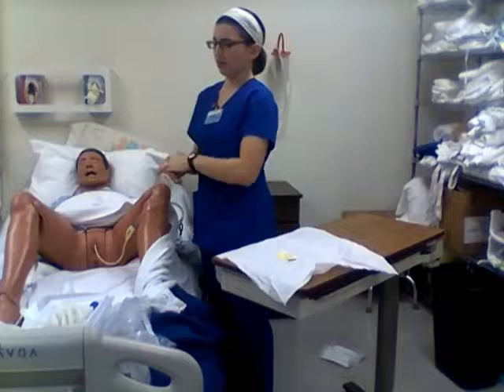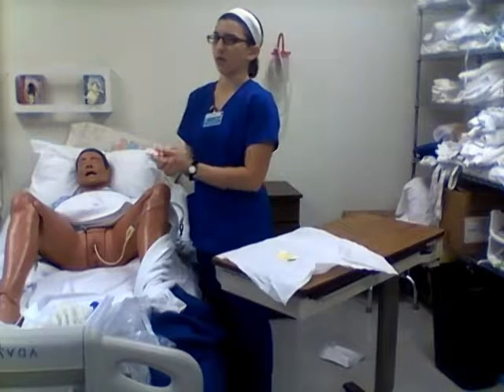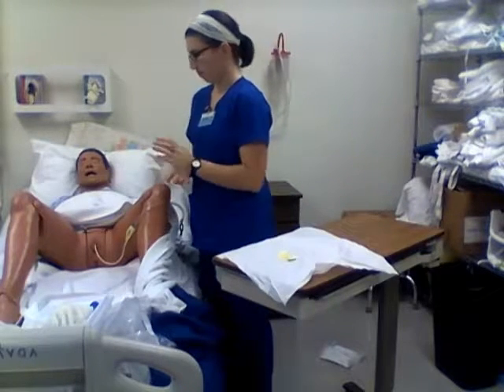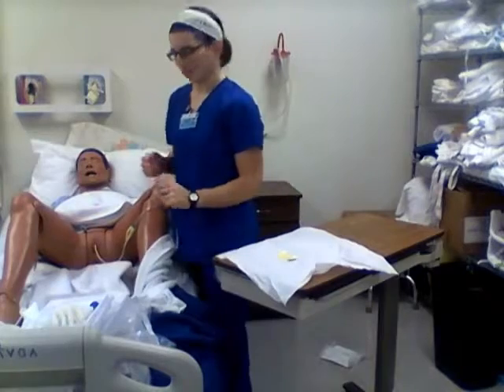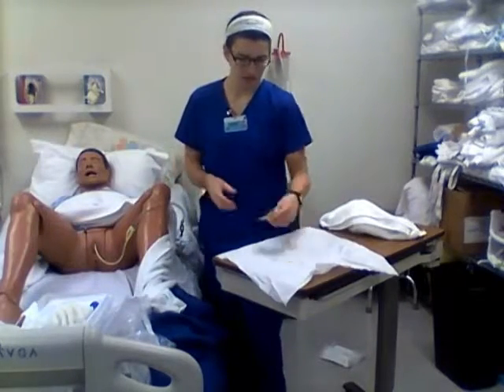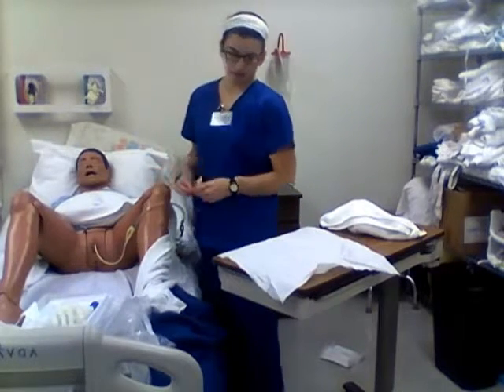And if she was feeling any discomfort, if she was feeling any pain, she could report that to me, and I could possibly help remedy that, or I'd have to document it, obviously, and anything else that could possibly go along with it, I could do that. So now I can go ahead. I've discarded all of my trash, pretend that's in the trash can, and I can make her comfortable again. And I would label my tubing with my signature and the date.